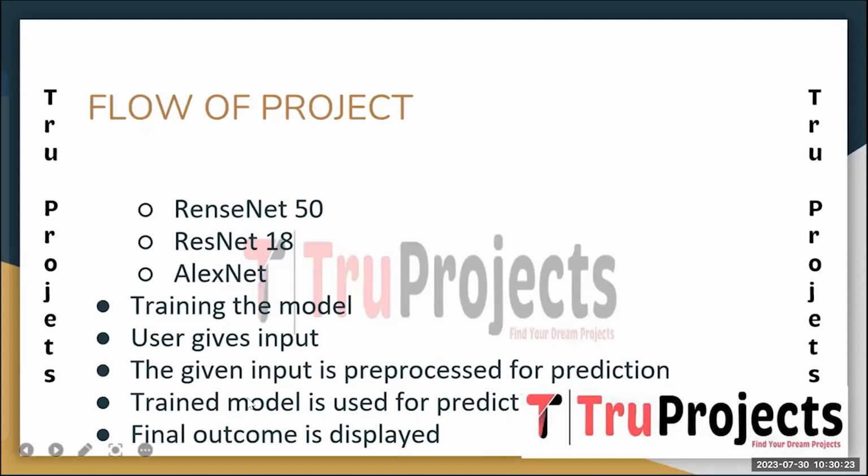And the next step is the given input is pre-processed for prediction. When the user submits an image, it undergoes pre-processing similar to the training data, including scaling and normalization, to make it compatible with the deep learning model.